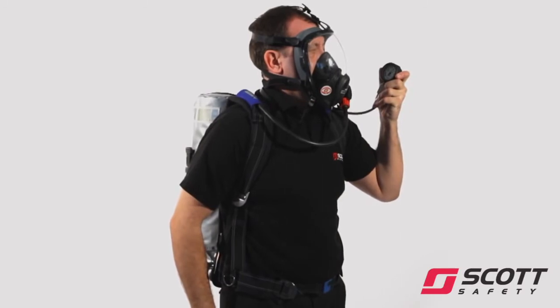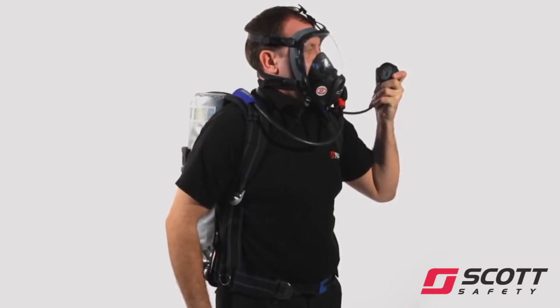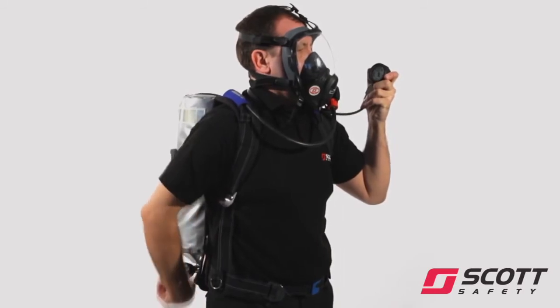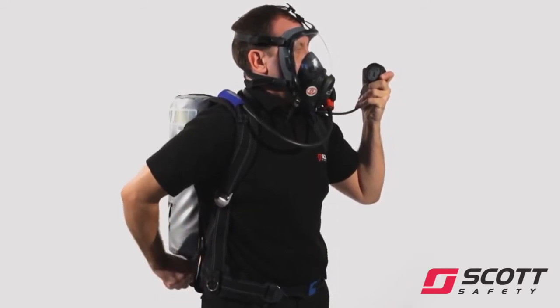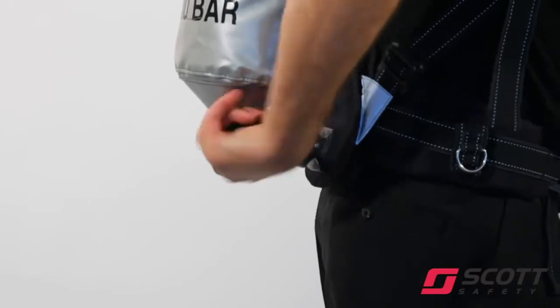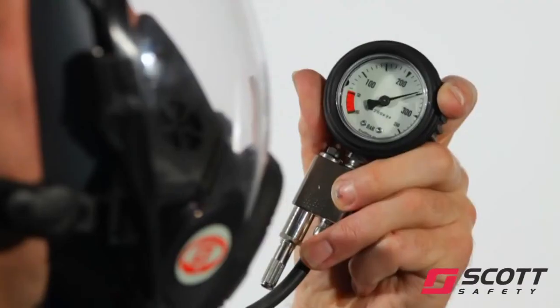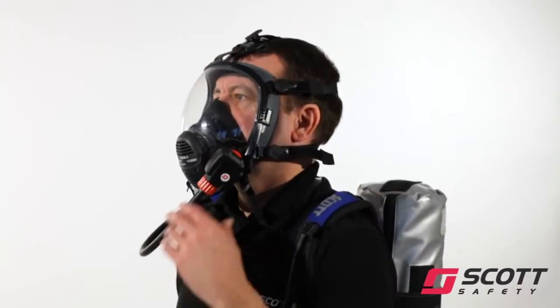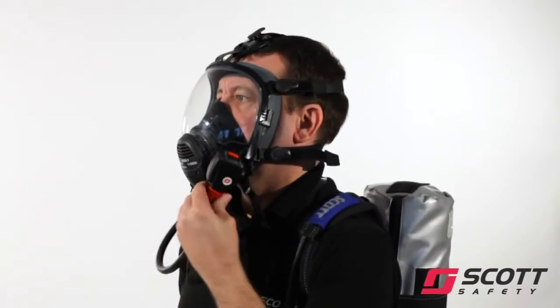With the cylinder valve still closed, slowly breathe down the system and check that the whistle sounds clearly at 55 bar, plus or minus 5 bar. Fully open the cylinder valve. Check that the cylinder valve is fully open and that the gauge shows sufficient air. Turn the bypass knob on and check for steady airflow, then close the bypass.